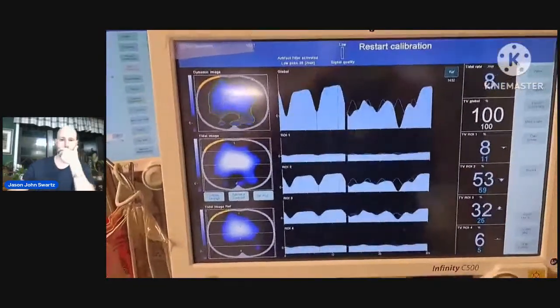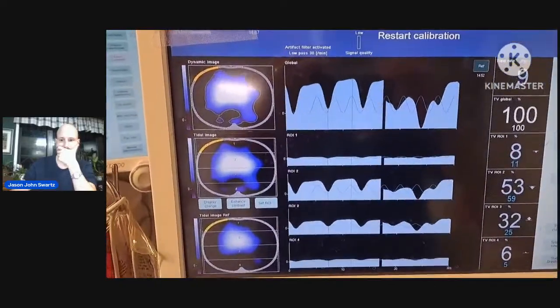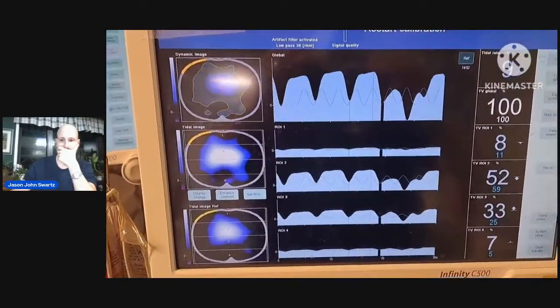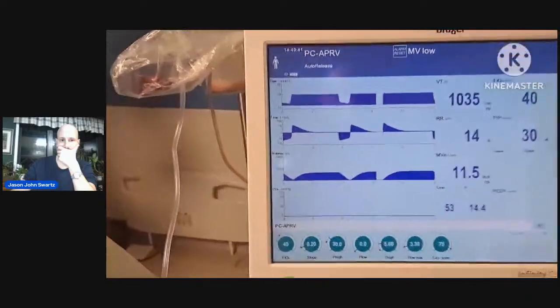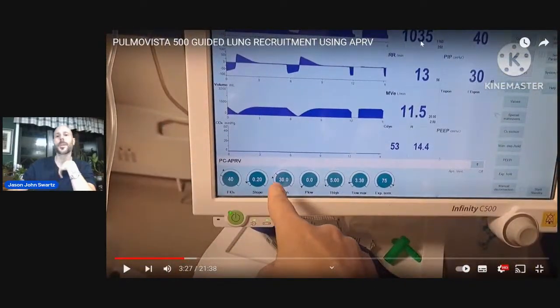All right, it's been another minute or two. Kept on titrating it right up to 30. So we're extending right now the volumes there. So that's what I was saying. See the slope point 2.